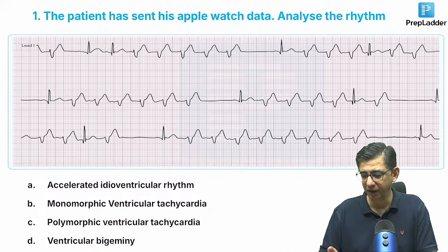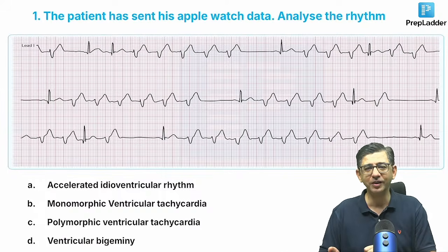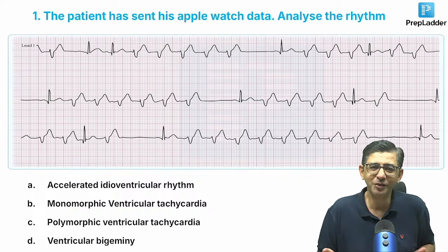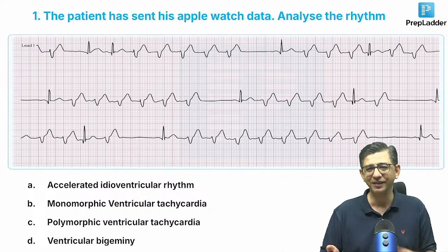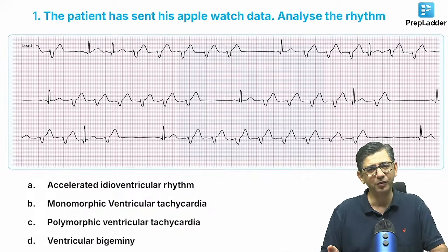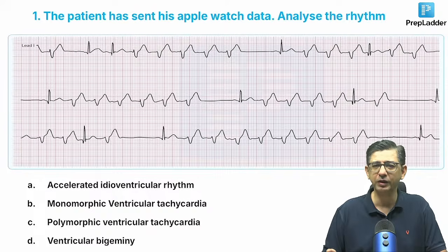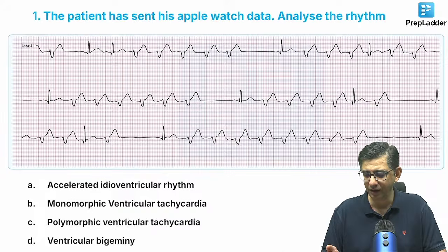Very good evening, everybody. Yeah, Apple Watch is not for analysis. It can record an ECG. It will not tell you a diagnosis, right? I mean, how can you expect a device to? It's a doctor who will tell the analysis, but it can conduct an ECG. They have put a disclaimer. If you are using an Apple Watch, it will itself say it's not useful for diagnosis of heart attack. It's only for detection of atrial fibrillation, where there would be an irregular rhythm.